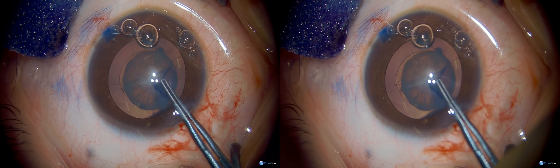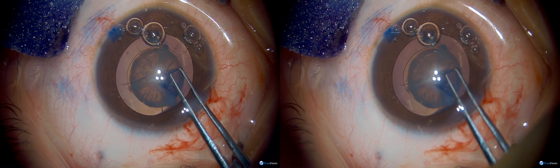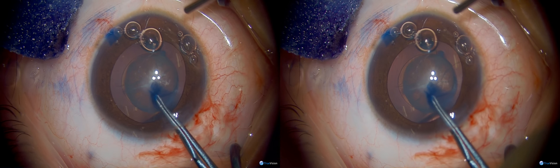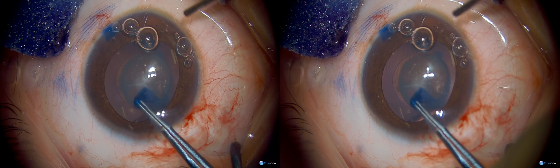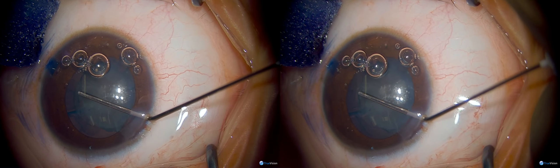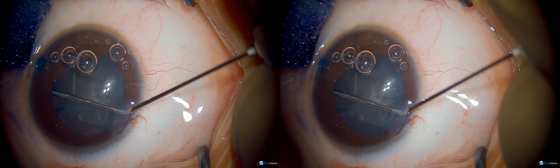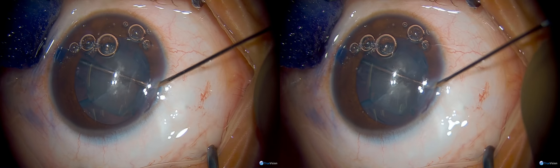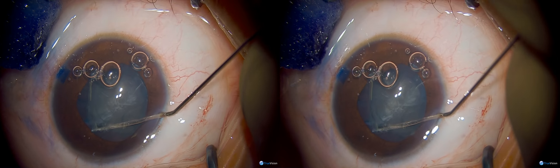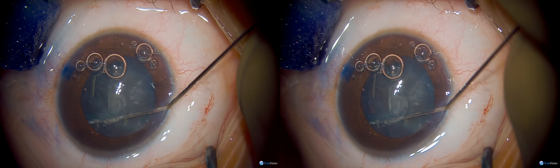Once we've got our anterior capsule completed, since there are no posterior capsule abnormalities in this case, we're performing some hydrodissection. The cortex in younger children is extremely adherent to the capsule, and it's always helpful to have that liberated in multiple quadrants to facilitate cortical cleanup. Sub-incisional cortex is particularly difficult in children given the adherence of the material.